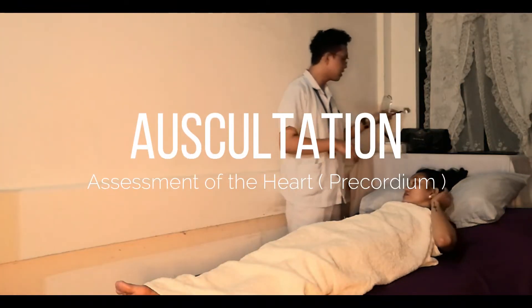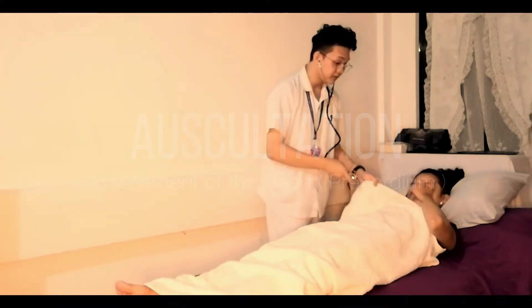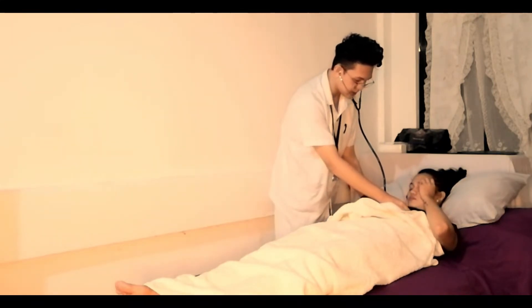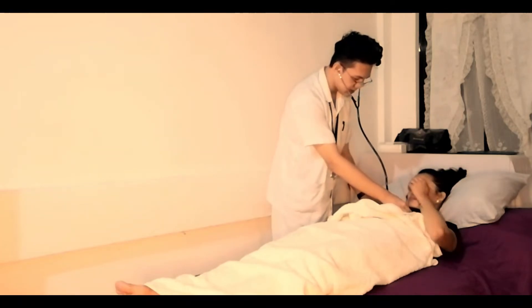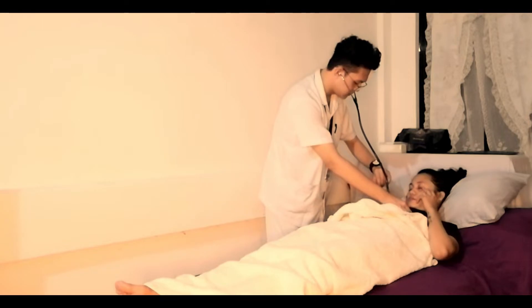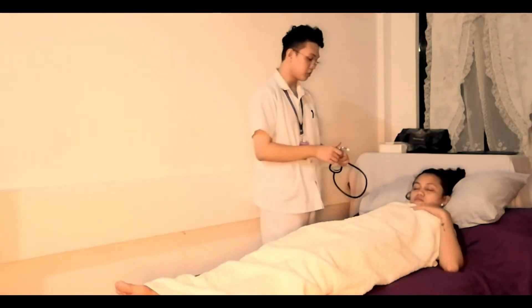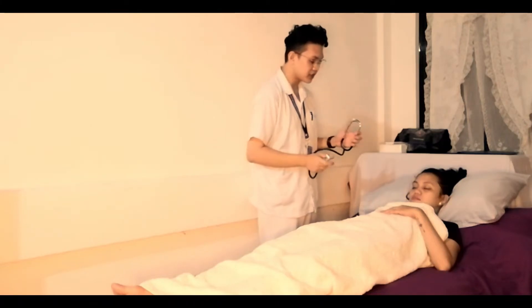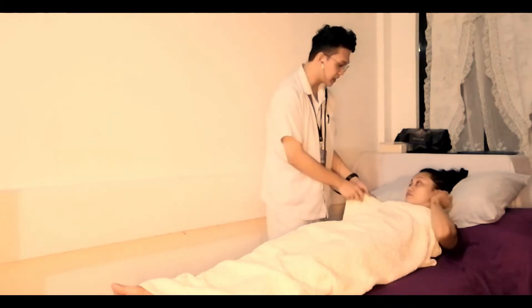I'll be assessing your heart rate using the diaphragm of my stethoscope placed on the apex, assessing the heart rate and rhythm. Your heart rate and rhythm is completely normal and regular. Now I'll be assessing for high-pitched sounds on your aortic, pulmonic, tricuspid, and apical areas.